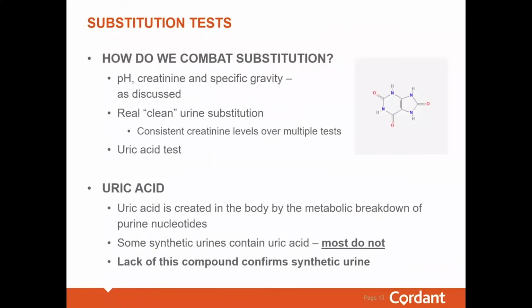So how do we combat urine substitution and adulteration? We talked about using pH and specific gravity, but what else can we do to detect tampering? Let's take urine substitution with authentic clean urine. This is definitely the most difficult to catch.